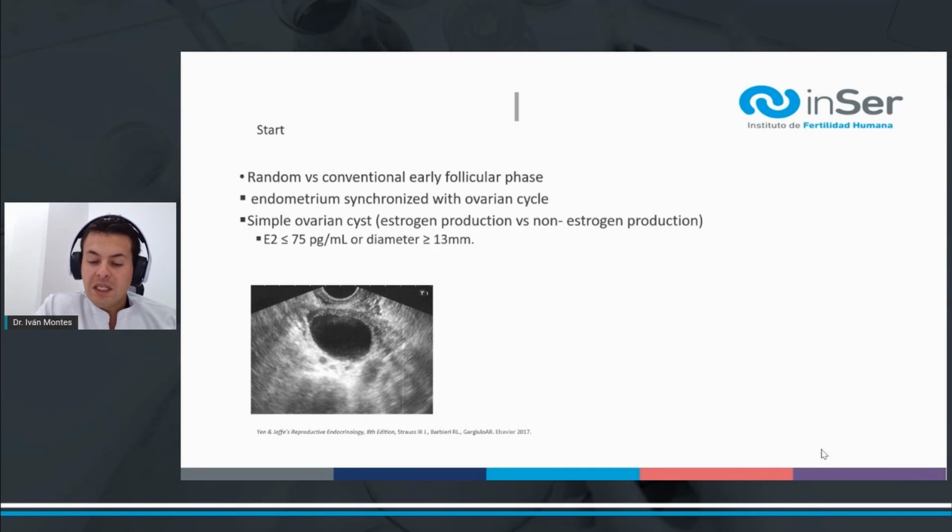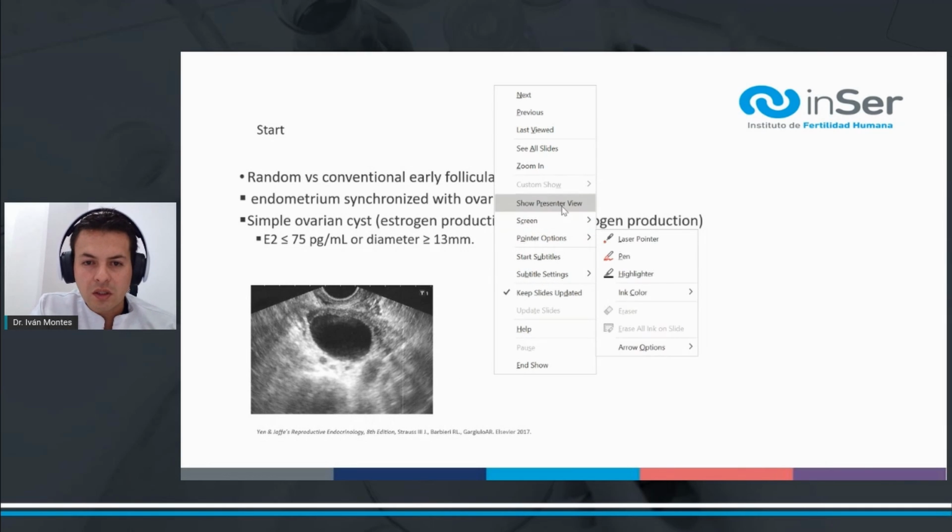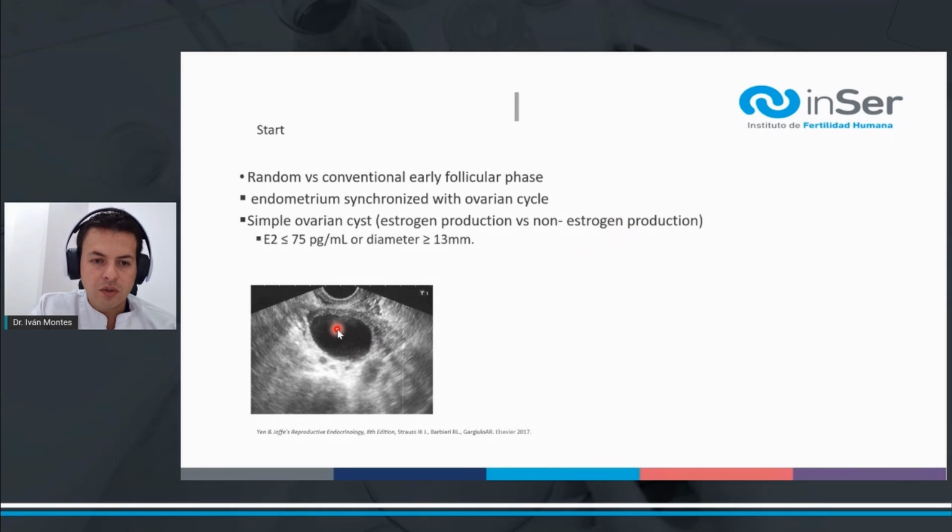of the menstrual period, identifying antral follicles without evidence of cysts larger than 12 millimeters, as you're seeing on the left side of the screen. And the thing with this kind of cyst is that it might be producing estrogen. And when these cysts are producing estrogen and you start the medication, it will decrease the response to the treatment and lose endometrial synchrony. So when you see this kind of cysts, it's better to do a test to check the estrogens and not start the medication.